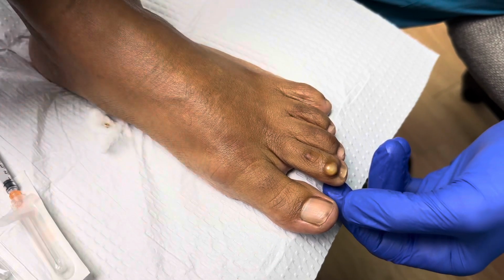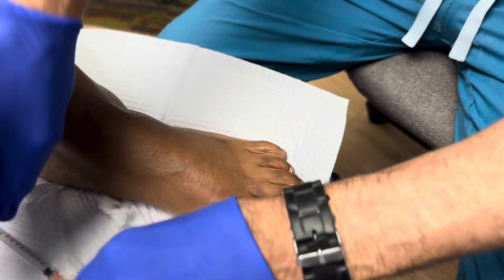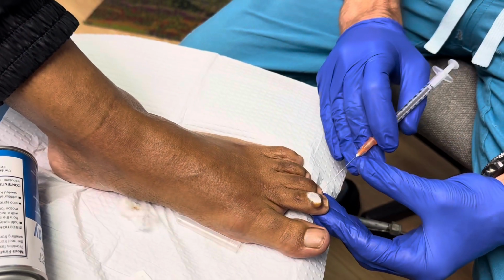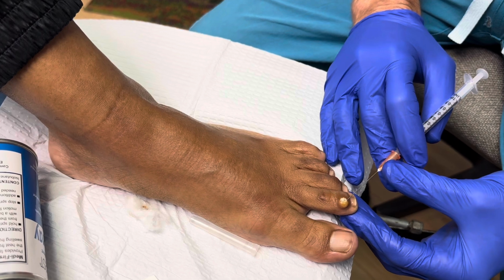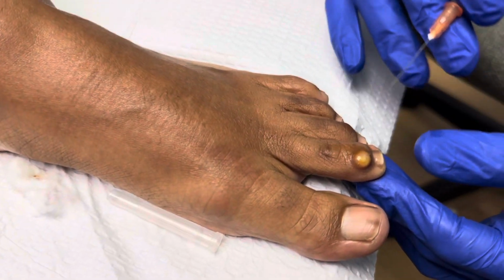So what we're going to do is, it's already been prepped with iodine. We're going to put a little cold spray right there, and we're just going to get a 25 gauge needle so it's not too abrasive, hopefully, right? And we're going to do a couple, and you can already see it's a little sticky there on the close-up.